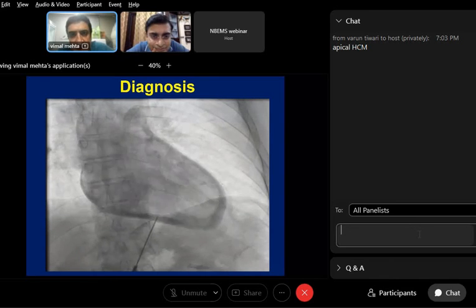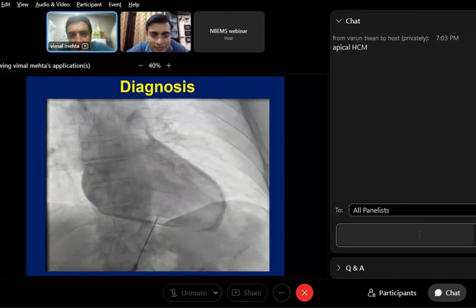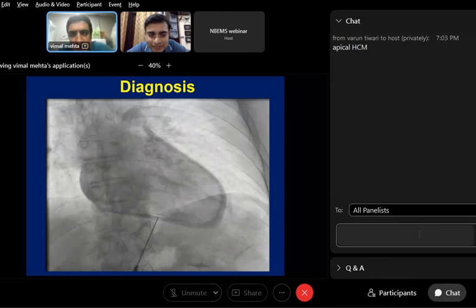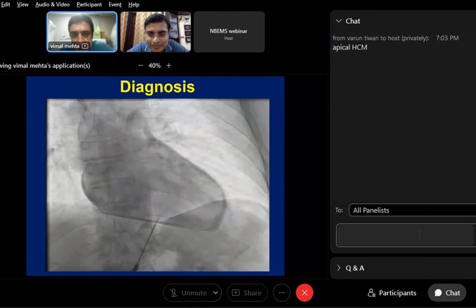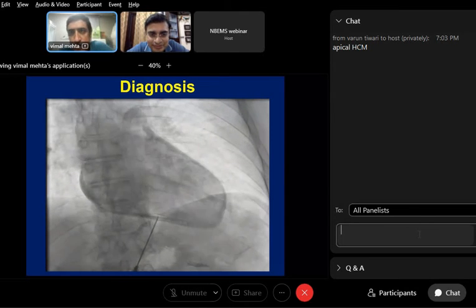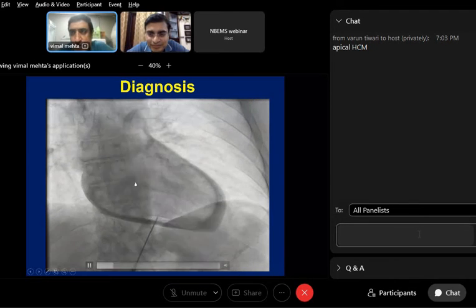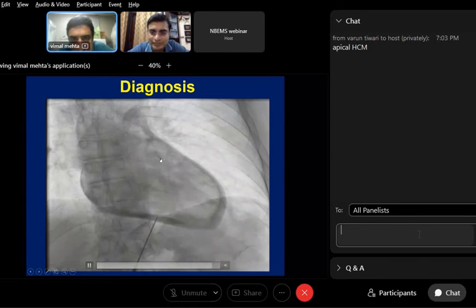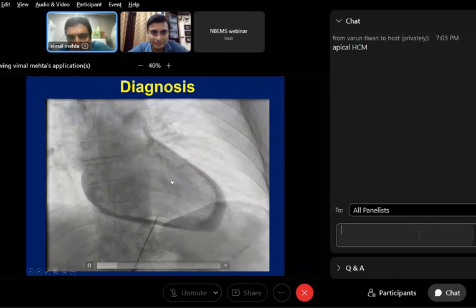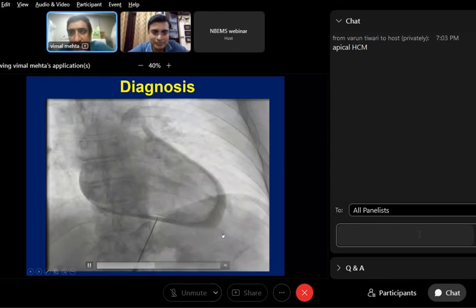Pericardiocentesis, LAD. Very good. Why? Quickly. I will not budge unless you answer. There is no point. I can show you. In this, I have 500 spotters. In this, they are in continuation mode. LAD perforation. Why? Can you see anything? Stent is very good. So you have to be attentive. You can see a stent beautifully. It is likely an LAD perforation. And importantly, yes, very good. Now you have come out very good.